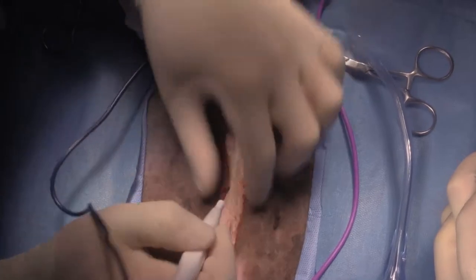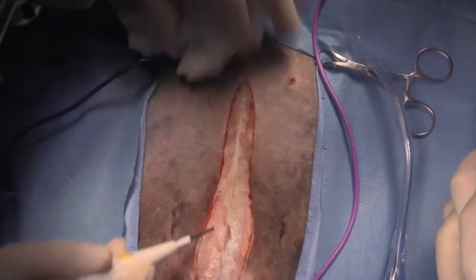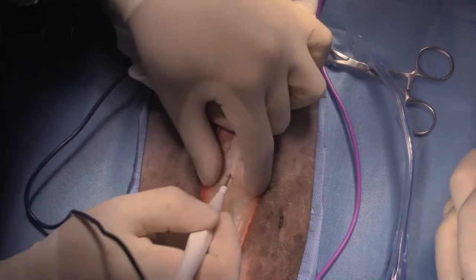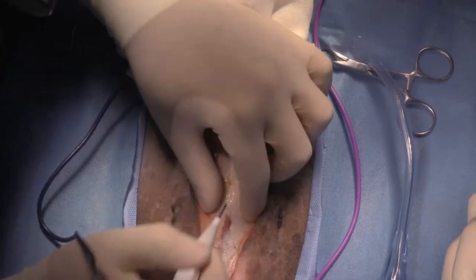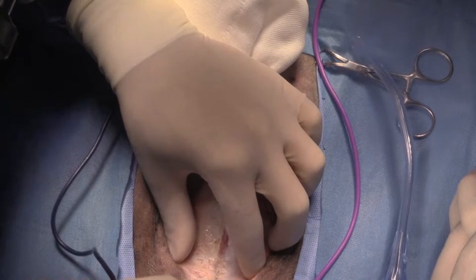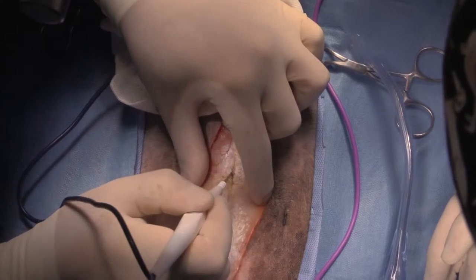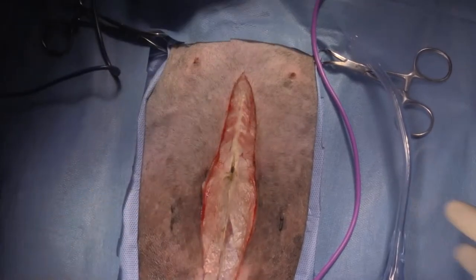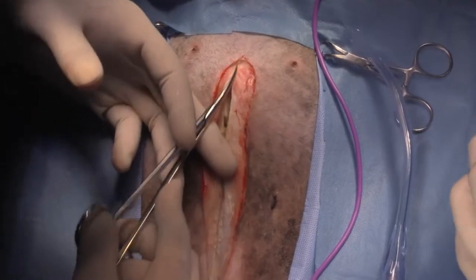So just coming through are a few X-rays for the live stream lately, and we can see where she was de-sexed. We can see the linea is looking a bit irregular there. So I'm going to come in just behind the umbilicus and make a very small hole through the linea with my cautery, and extend my linea incision. Just drop through like that and extend my incision with a pair of scissors, then elevate and do a push cut along here.